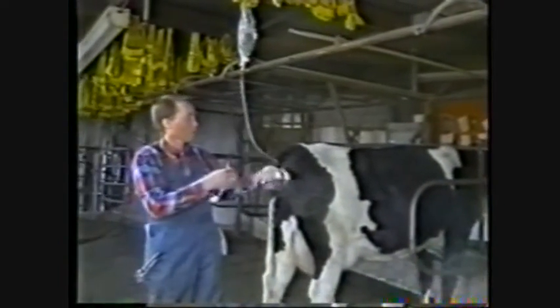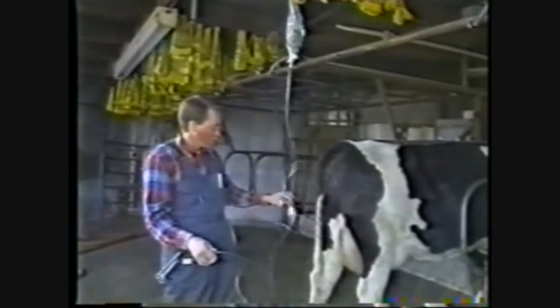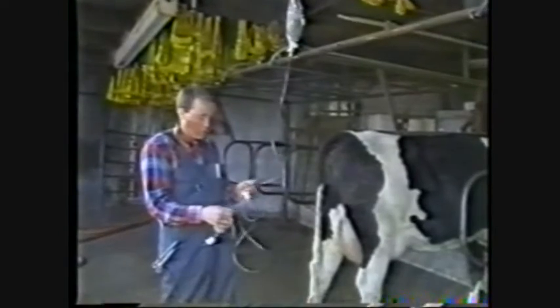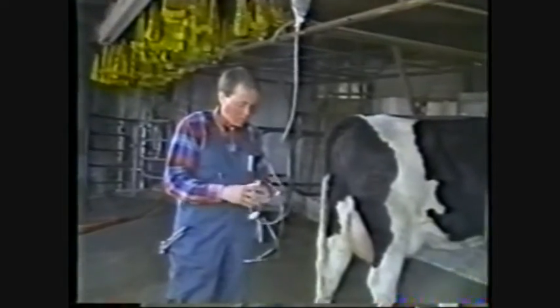Okay, now we're going to demonstrate embryo collection from start to finish. We have a 1 liter bag of solution hanging above. We've placed the 1% serum concentration into it. It's a good idea first to take your flush filter so the lid is on good and tight. Let's place a small amount of fluid into the cup first.